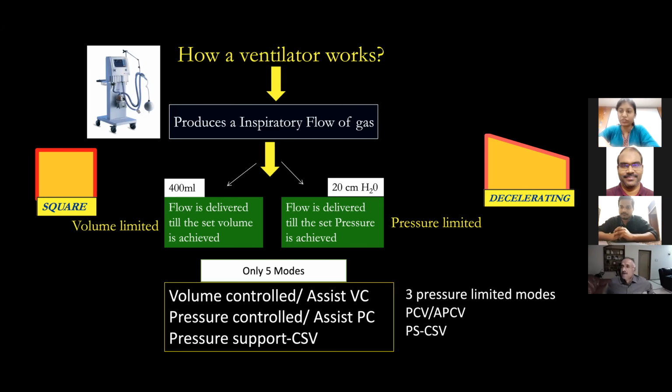So what are the 5 modes the ventilator can produce? Only 5 modes the ventilator can produce. Dr. Nisha? Sir, the volume control, pressure control, assisted pressure control, and pressure support. These are the only 5 modes.